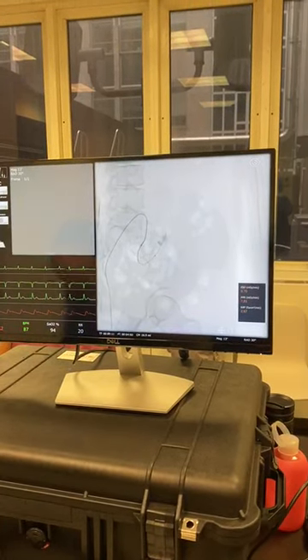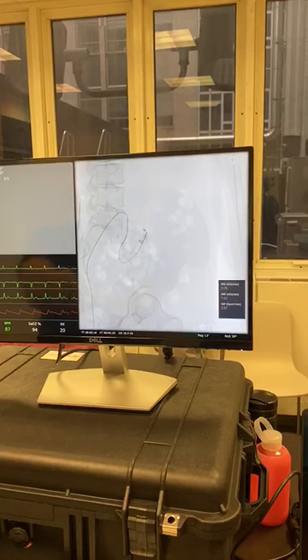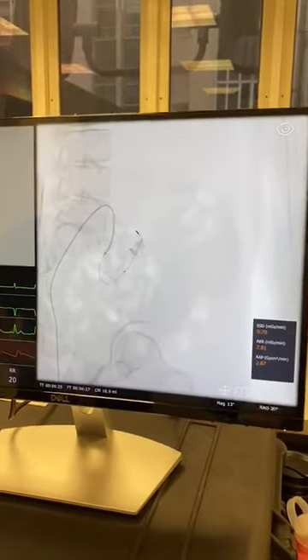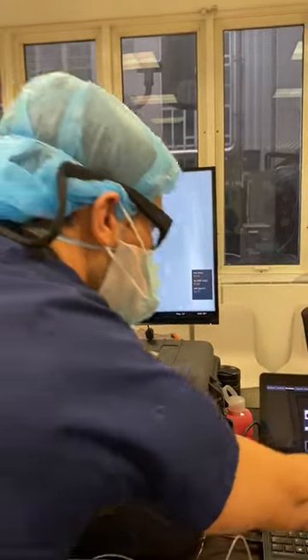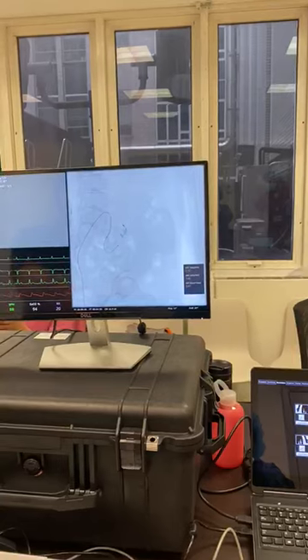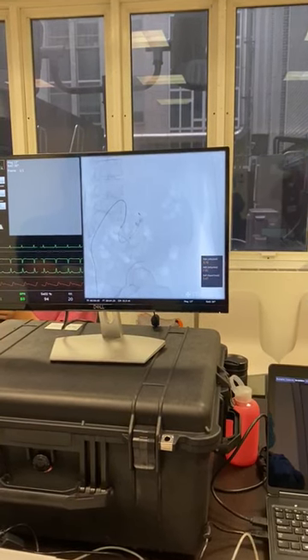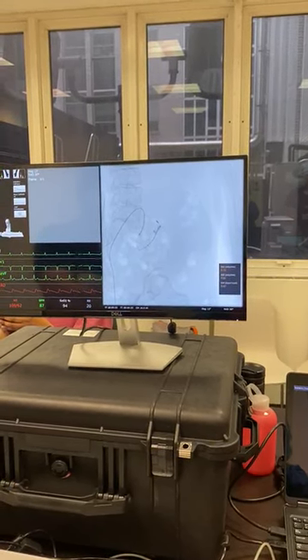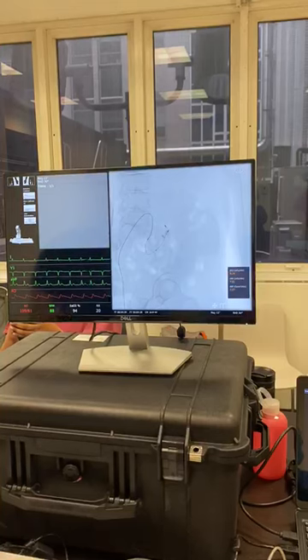Now that we see the coil coming through and getting out of the catheter, we're going to pull back a little bit. He delivered one coil. Pull back the wire and then we'll deliver a couple more. I'm going to pull back the micro a little bit and deliver a little bit more proximal. You can see him placing the coil right there — it's bunching up in the vessel and that causes the mechanical obstruction. Now he's going to place one more just proximal to that area of injury.